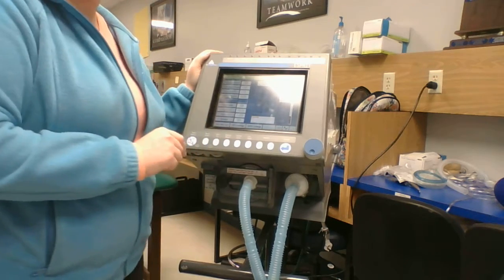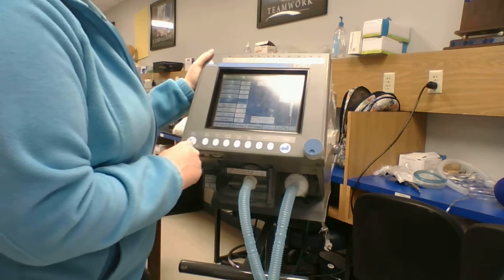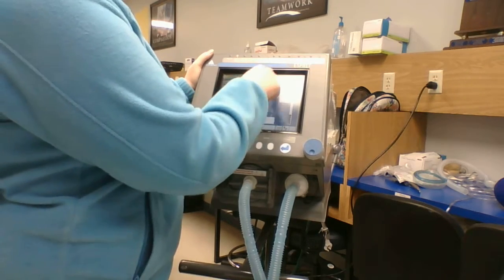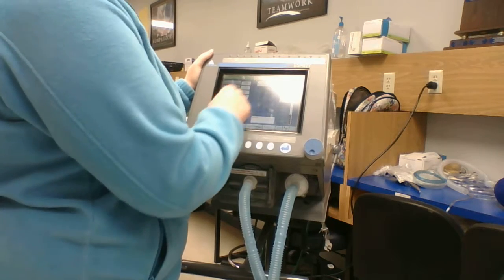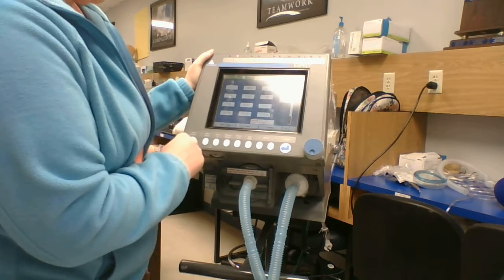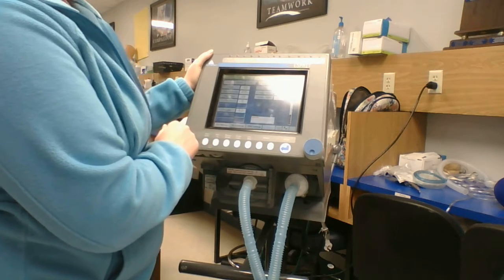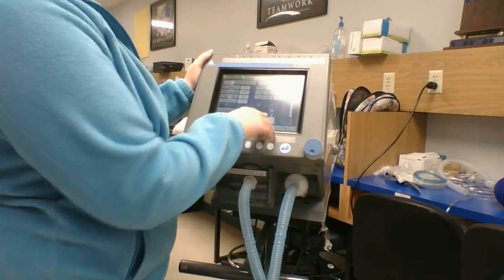It says low O2 because my oxygen on the wall is not reading where it should be, so I'm just going to silence the alarm. It says low tidal volume mandatory, so I'm going to go over and look at my patient data. So it looks like they're getting a tidal volume of 301, and I have their tidal volume set to 475, and they're only getting a tidal volume of 303.